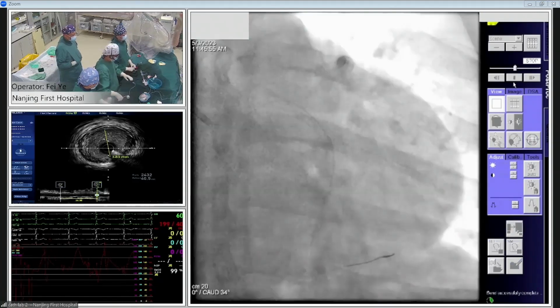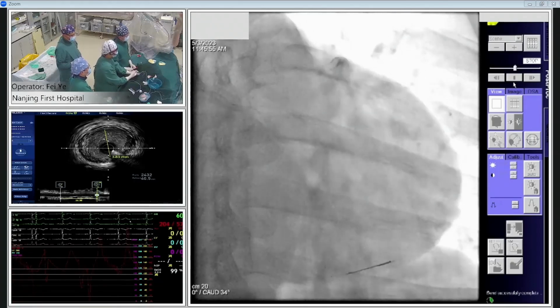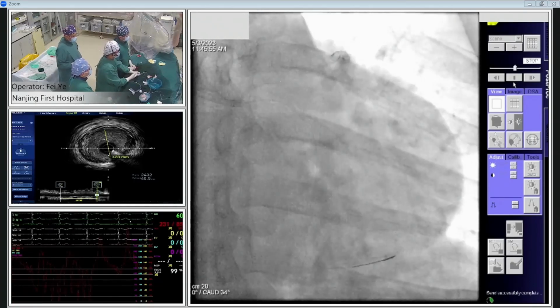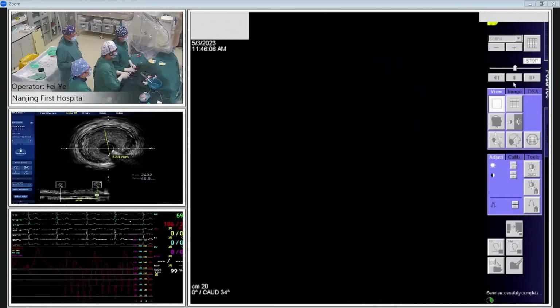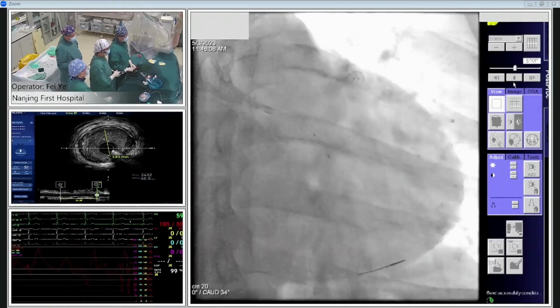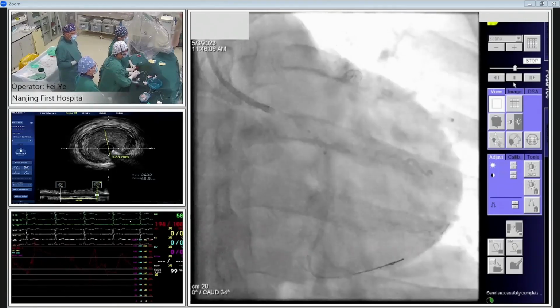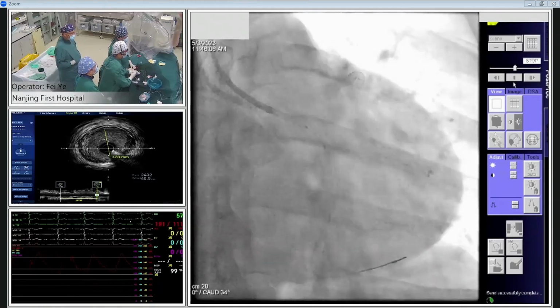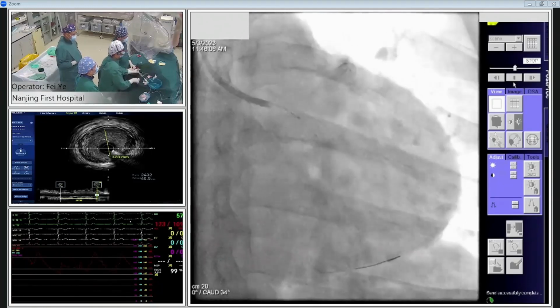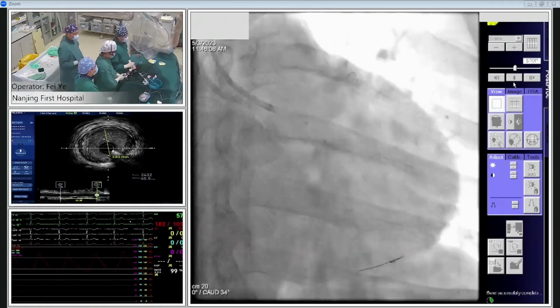The POT is very important. Just as Dr. Yin mentioned, we should avoid the distal edge of the POT balloon extending past the carina. Otherwise, we will cause the carina shift again, especially for this very difficult access, wide angle bifurcation. Now let's do the test. Okay. I think POT is very important. Okay, to use a special POT balloon.